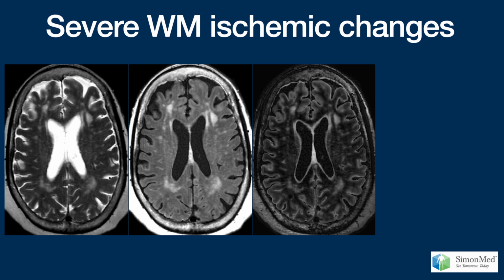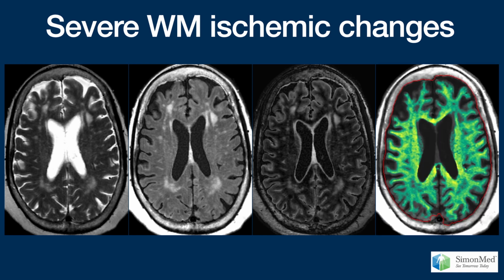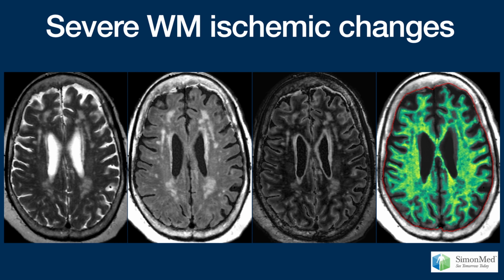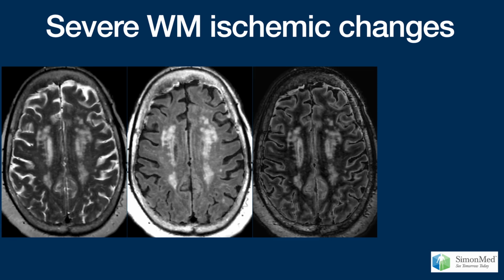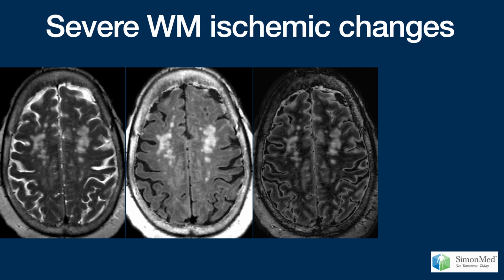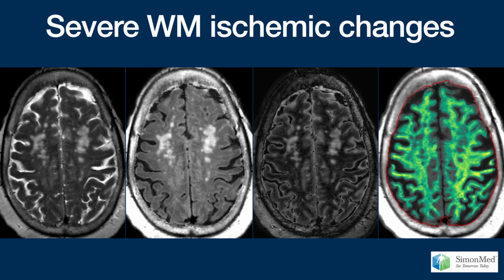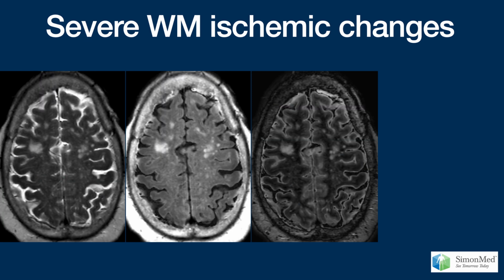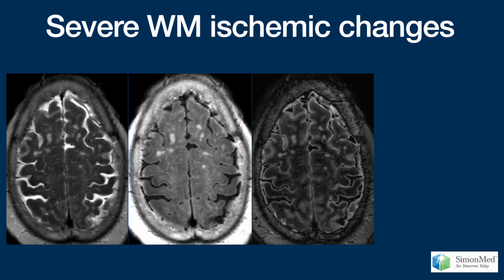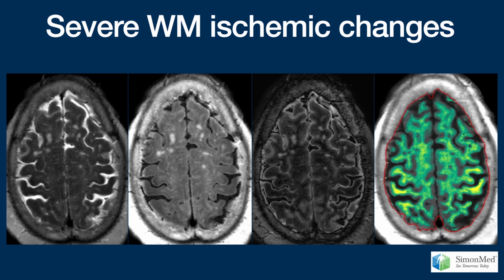T2, FLAIR, and DIR, myelin. T2, FLAIR, and DIR, myelin.